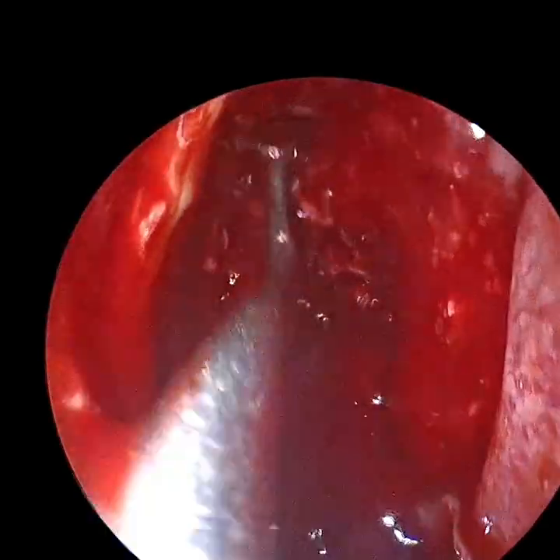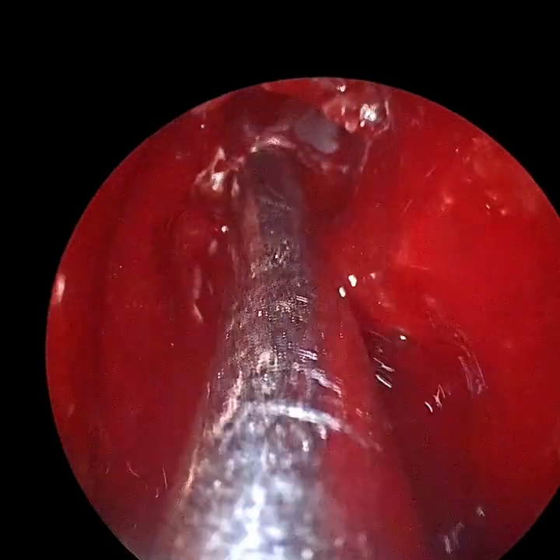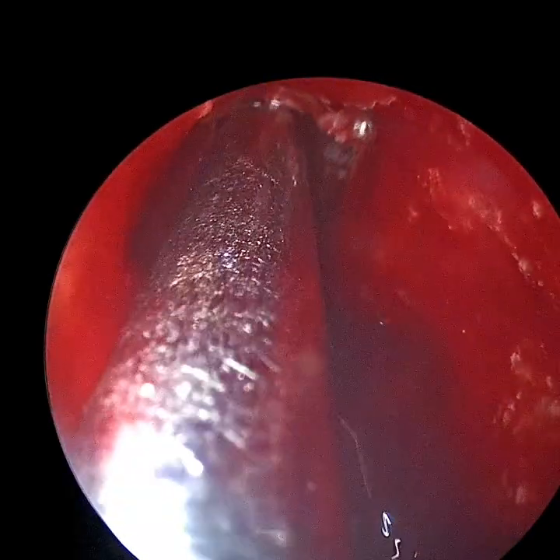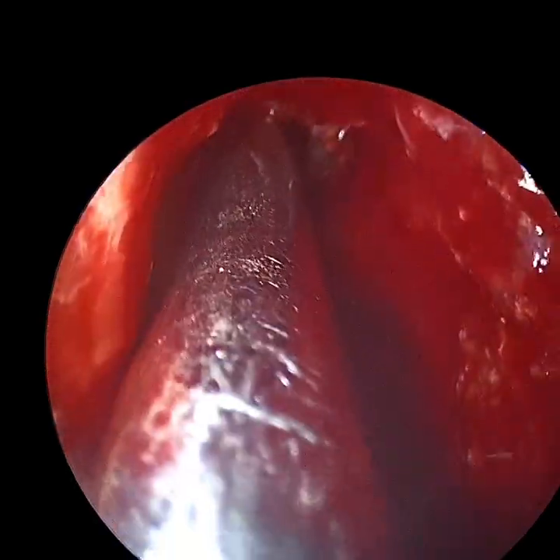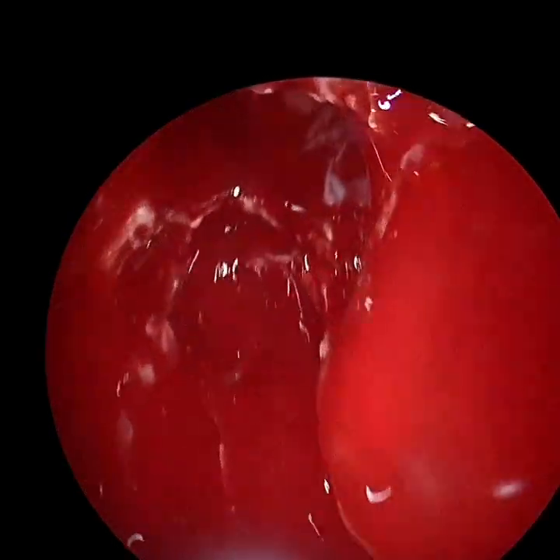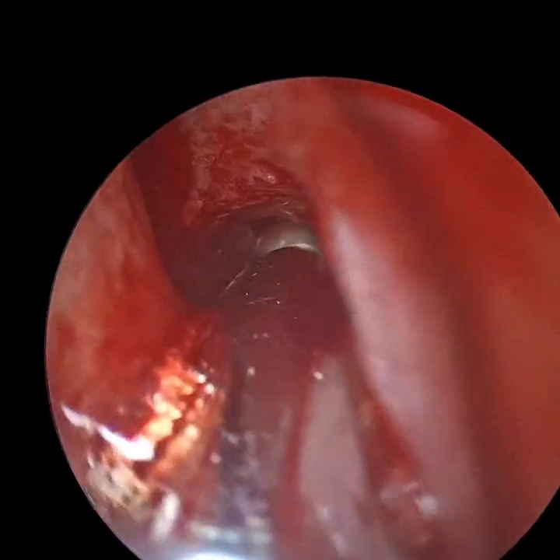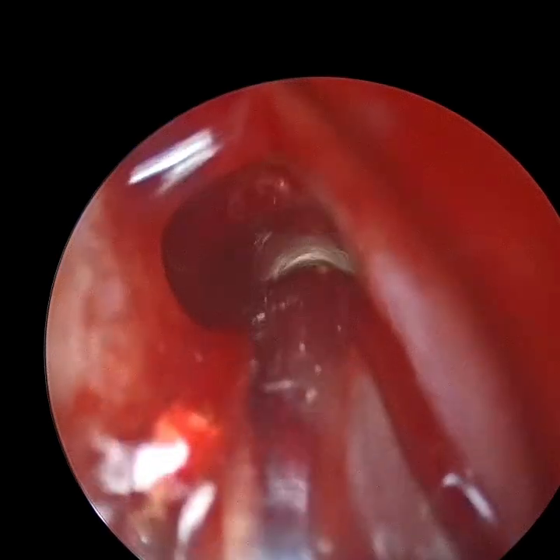Because once we take the nasofrontal beak, there is a direct access on the right side to the frontal sinus. And now you see with the 0 degree only, we are able to reach the frontal sinus and then remove the disease from inside the frontal sinus. This all is with the 0 degree. Now coming to the opposite side, so again the same problem was on the left side.